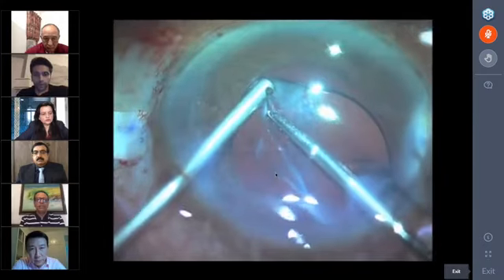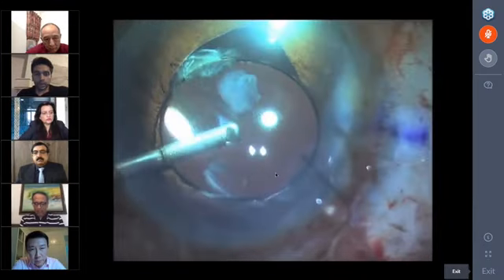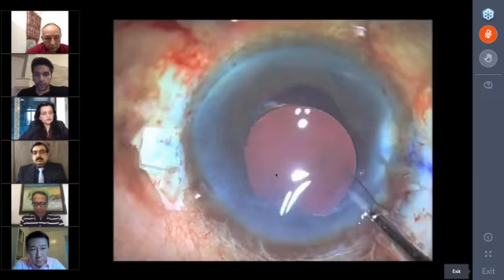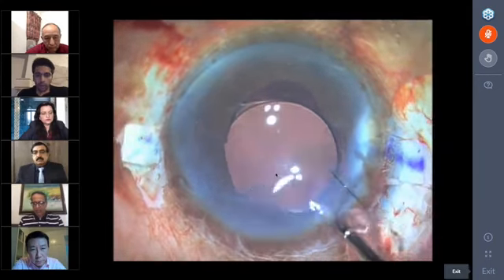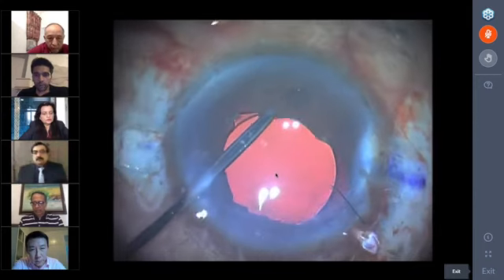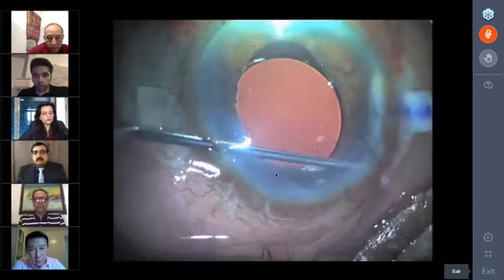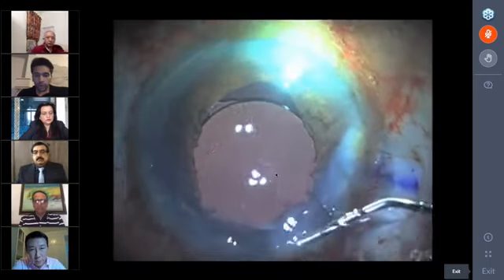Now I'm using a vitrectomy cutter to cut off any bag remnant that is attached to any vitreous component over there. Once this is done, I really have a good round. Now I have all my bag remnants out. I'm trying to make sure that my pupil is round enough. If you don't, nowadays I also do a pupilloplasty of sorts. There was some amount of vitreous which I did go back and remove.